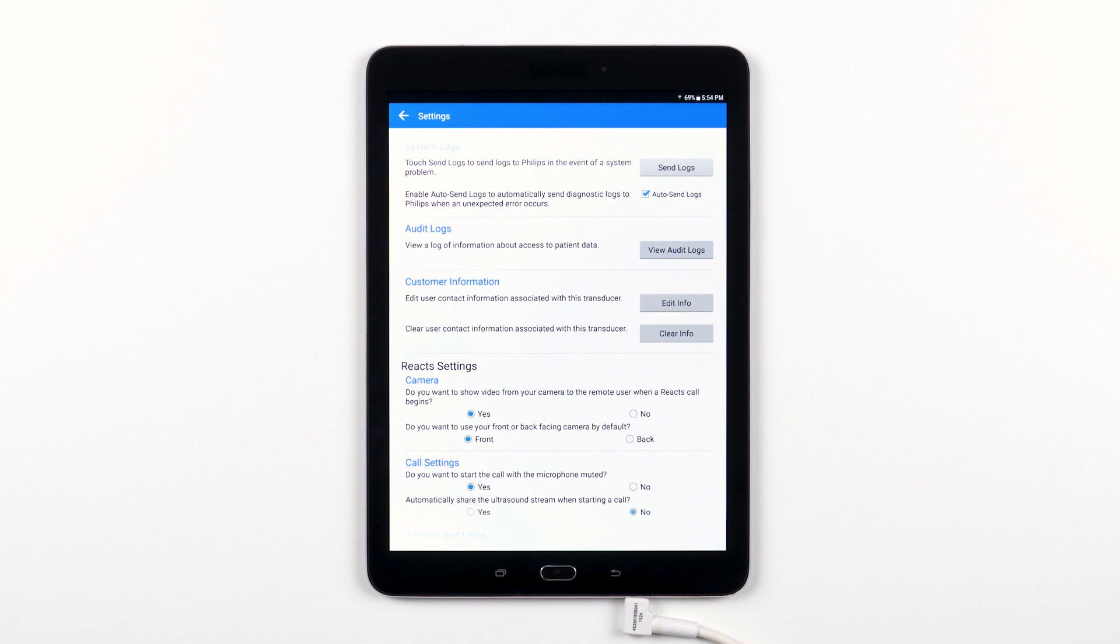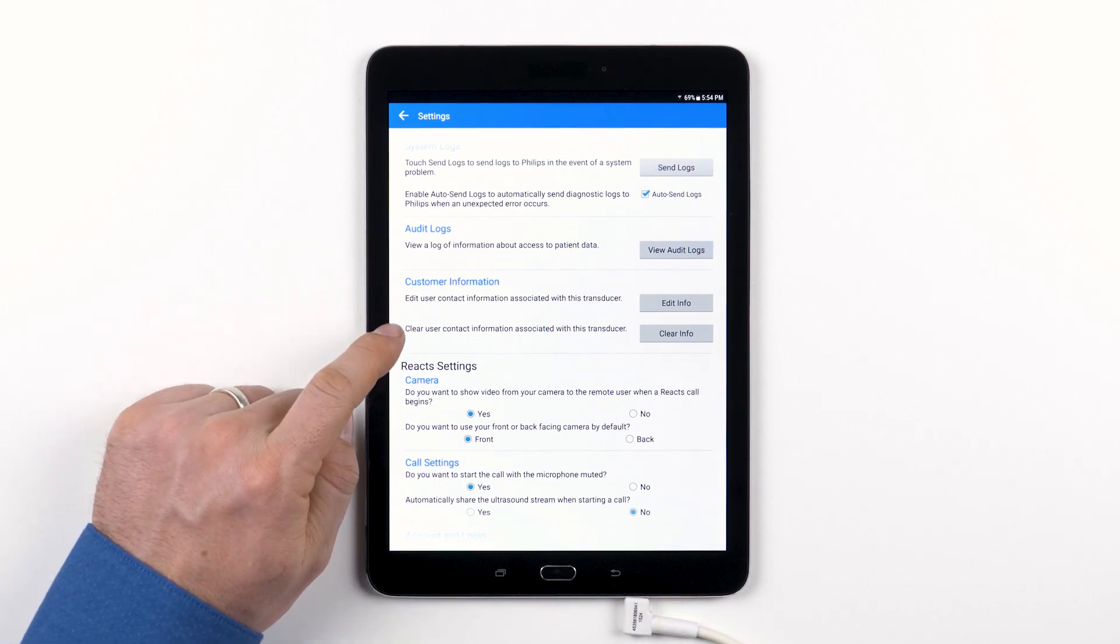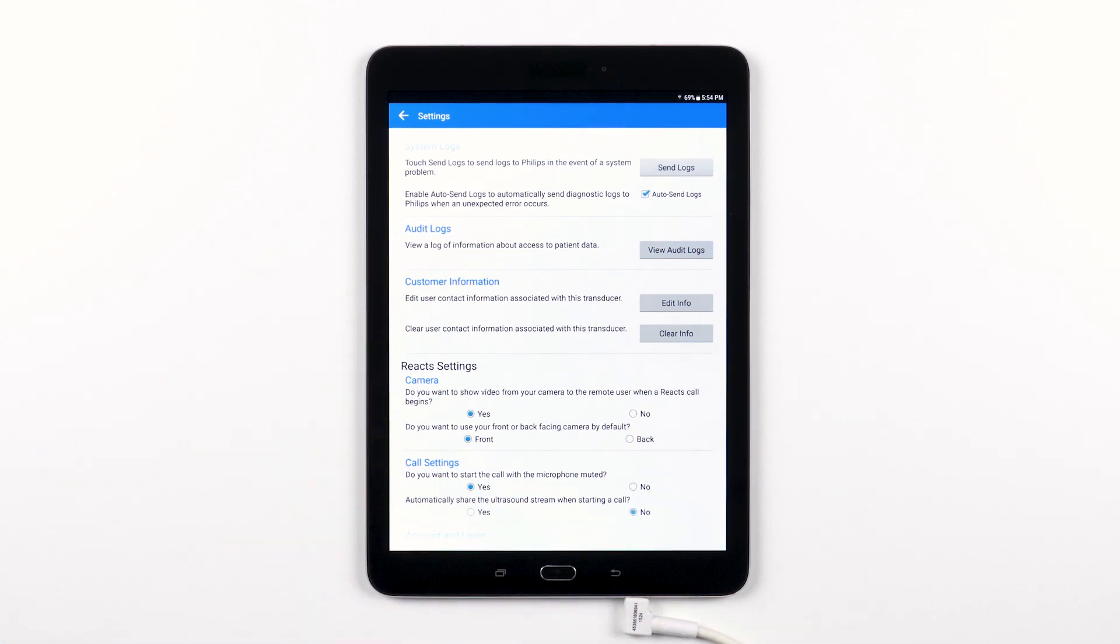The customer information section is where you have the option to edit or erase the information you provide when you register your transducer.